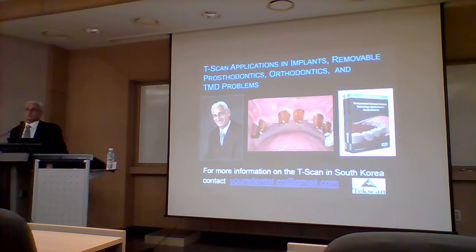Any weak points? Yes, the weak point is that you have to learn how to use it well. It doesn't work by itself. And that is a weak point because a lot of dentists who have it don't really get out of it what it's capable of. That's because you have to develop skills that you're not taught in school.